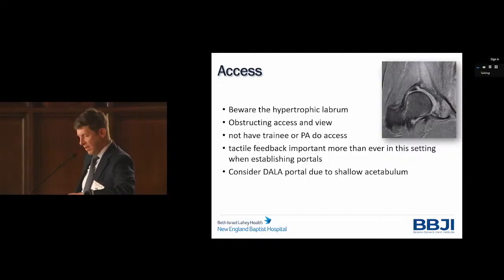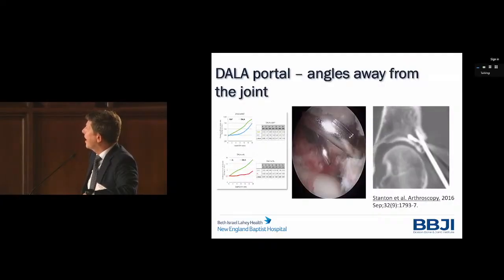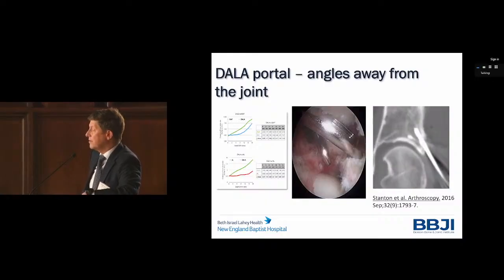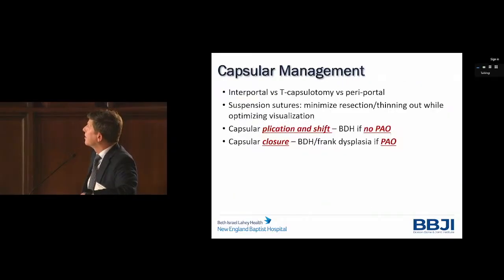Also, in this setting, particularly the DALA is a very important tool. Looking at the DALA portal in the picture on the left, you see a switching stick and a drill guide, so different angles coming into the joint. Obviously, in dysplastic patients, you're dealing with a shallow acetabulum, and you don't want to perforate into the joint. So a curved drill guide and the DALA portal are probably a good idea in this setting.